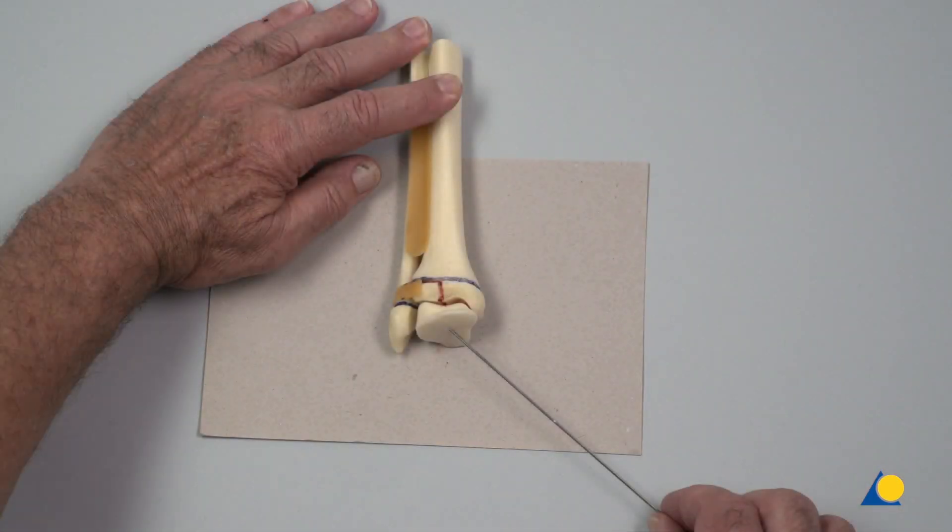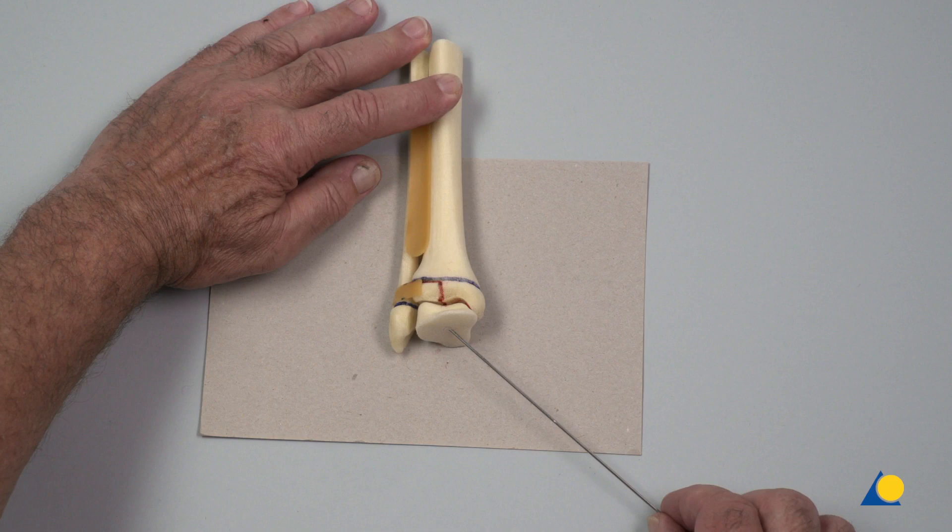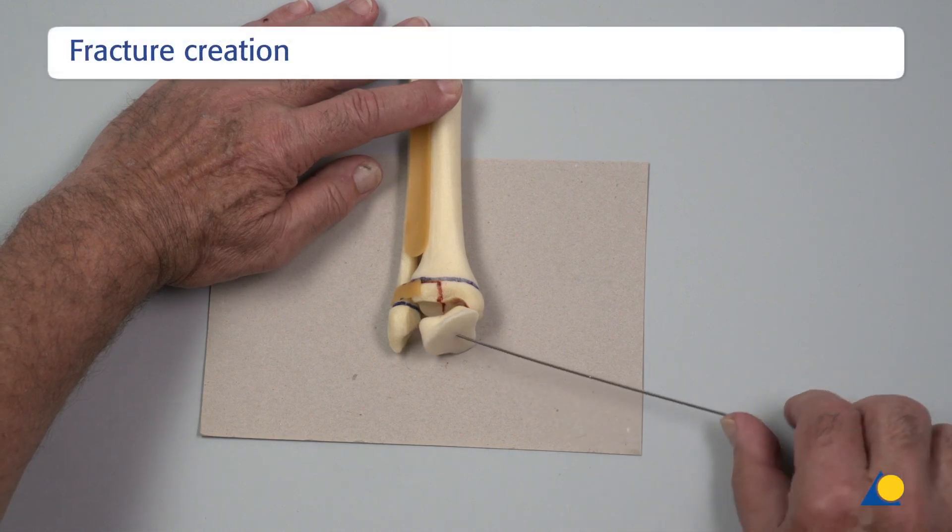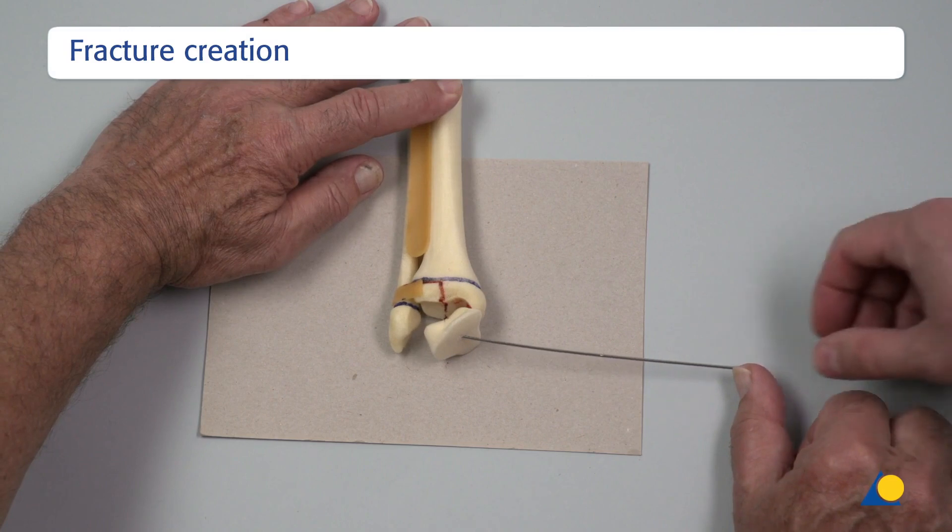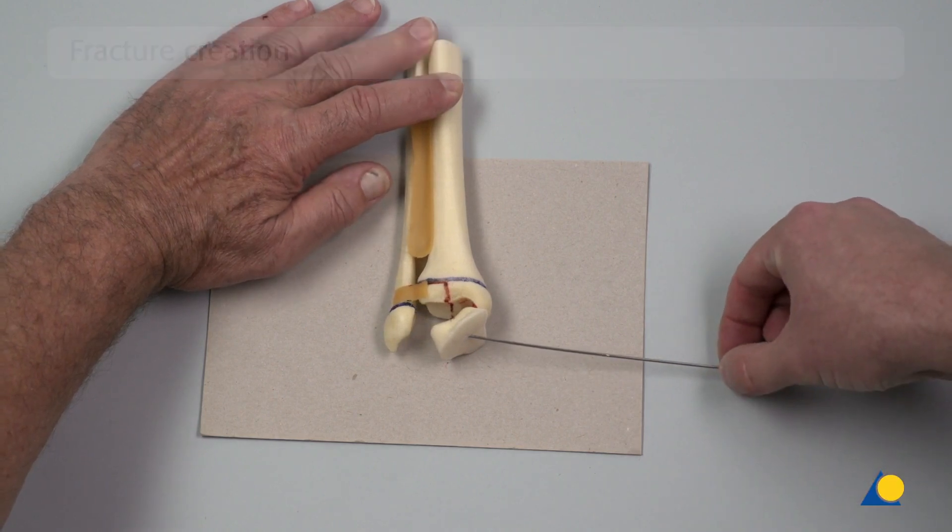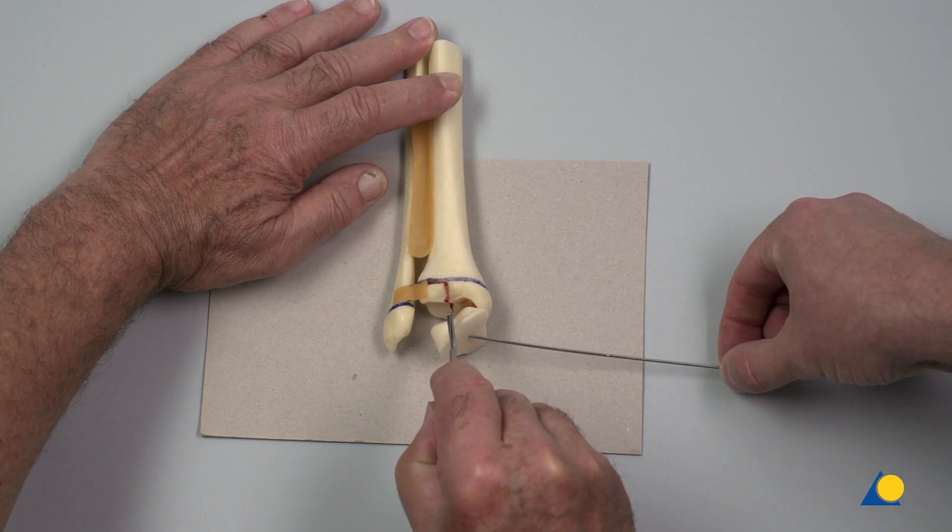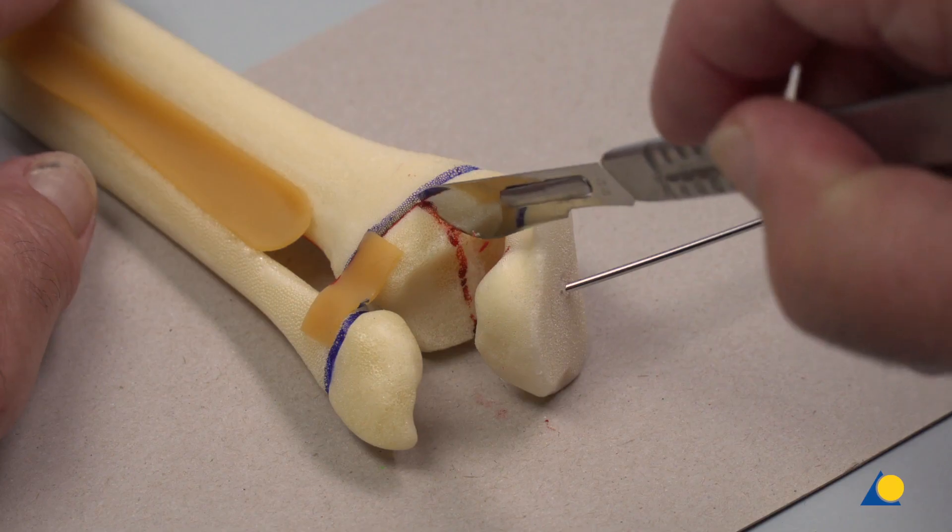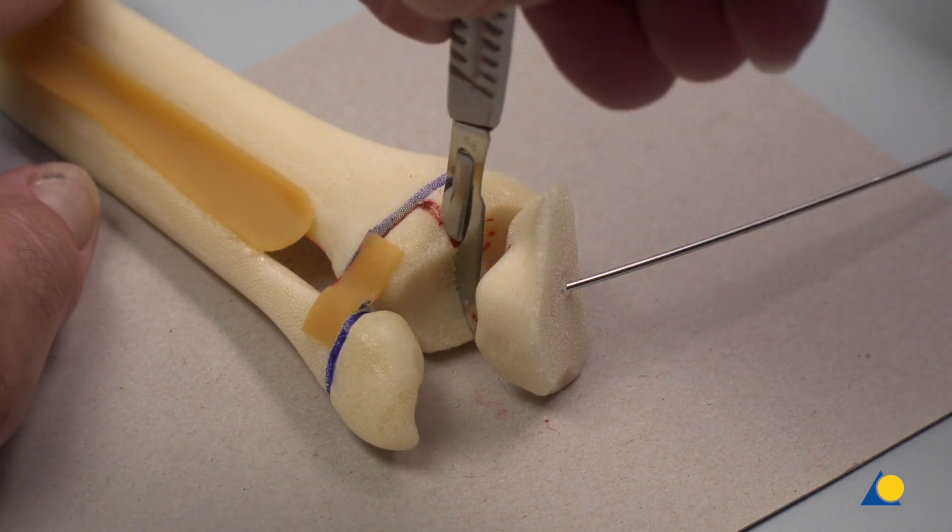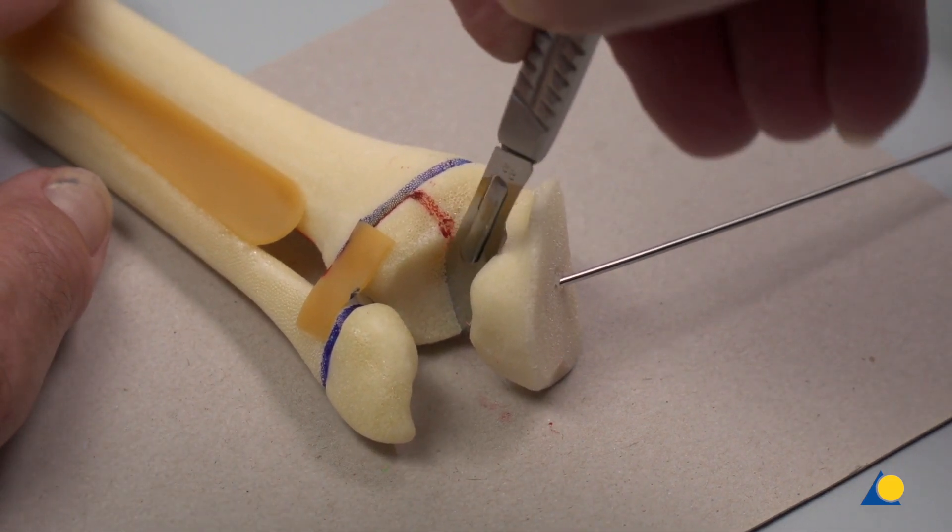A cutting mat has been introduced in order to protect the table surface and preserve the sharpness of the scalpel. With oscillating movements, a sagittal cut is created through the red line, starting at the level of the physis and then down along the level of the joint surface. The talus is pivoted out of the way and the joint cut is completed.